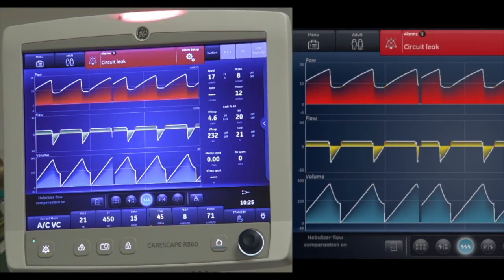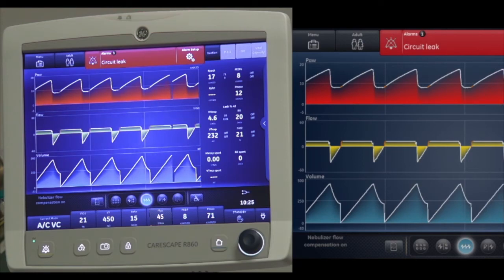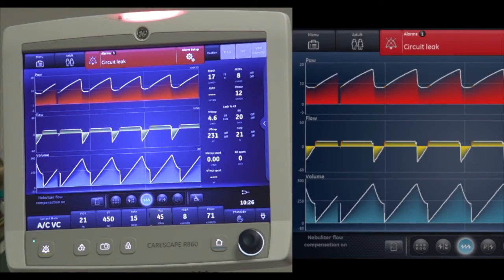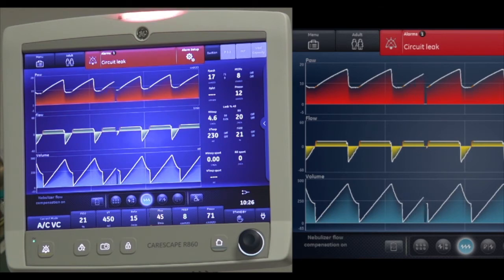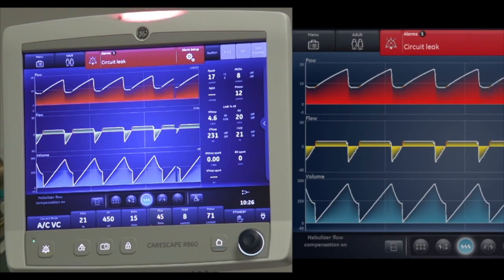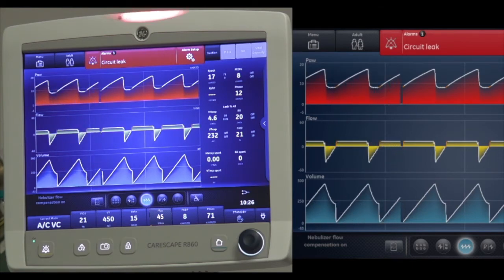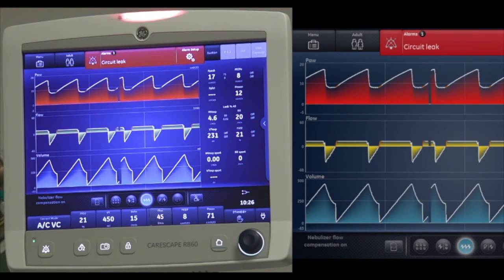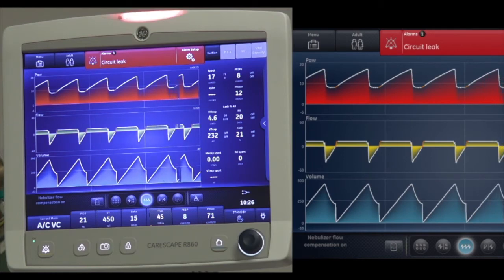Here is an example of what happens if you forget to turn off the nebulizer flow compensation after medication delivery. If the wall source or external flow source is turned off while the ventilator still thinks the flow is being delivered, your measured minute ventilations will be much different. This can also cause the ventilator to auto-trigger, resulting in a higher respiratory rate — in this example a rate of 20, while the set rate is 15 on the test lung. If your leak alarm is set appropriately, you will also see a circuit leak alarm.